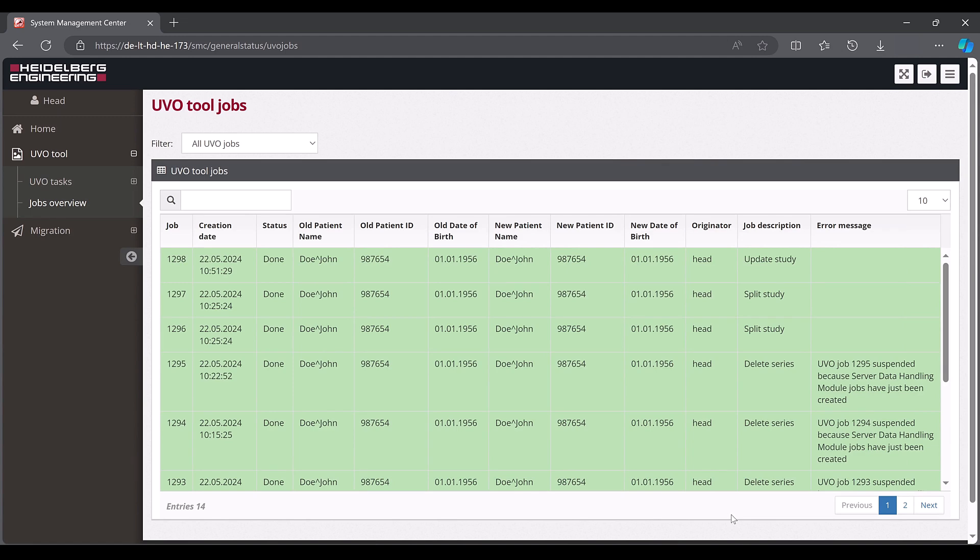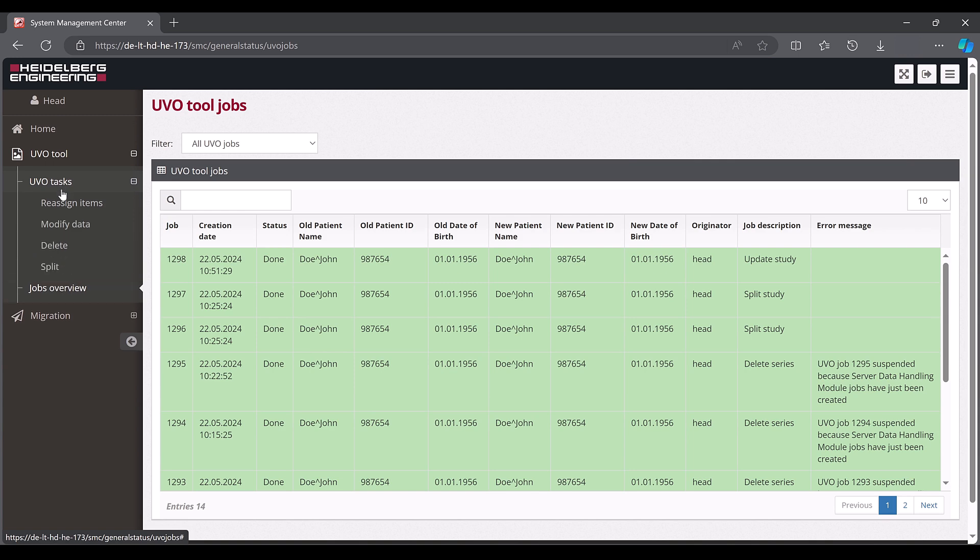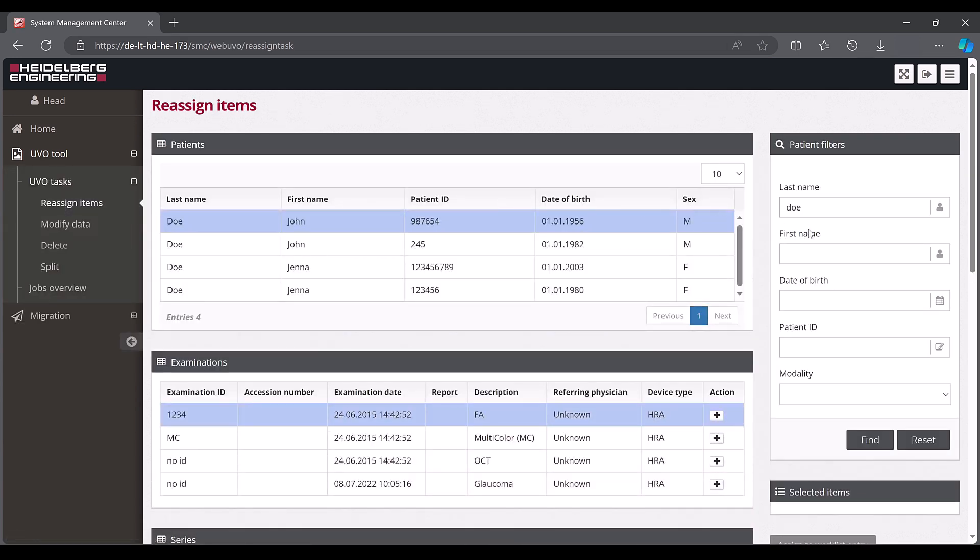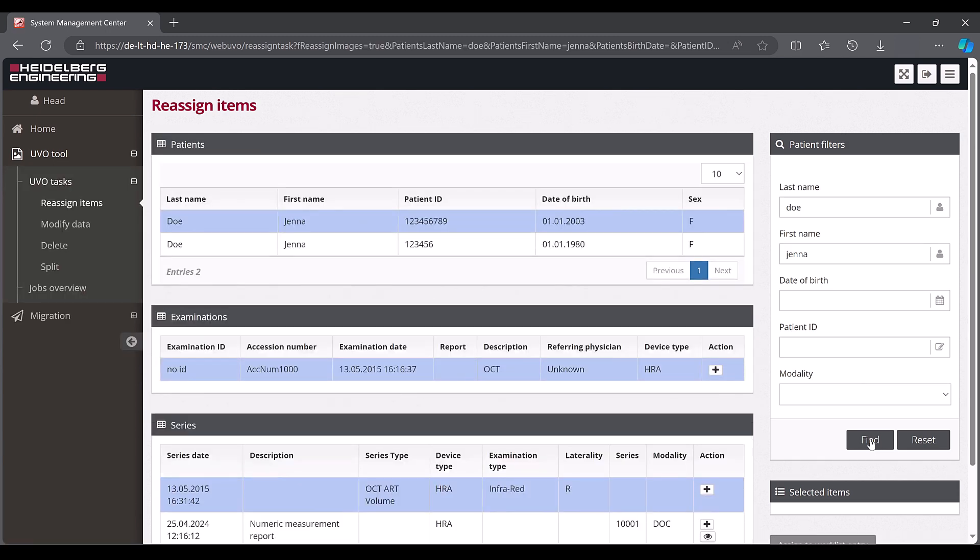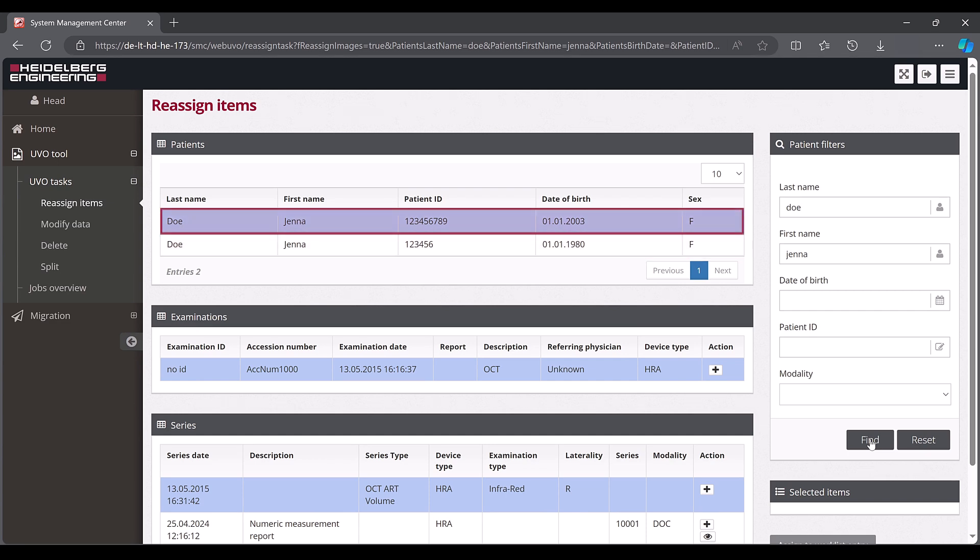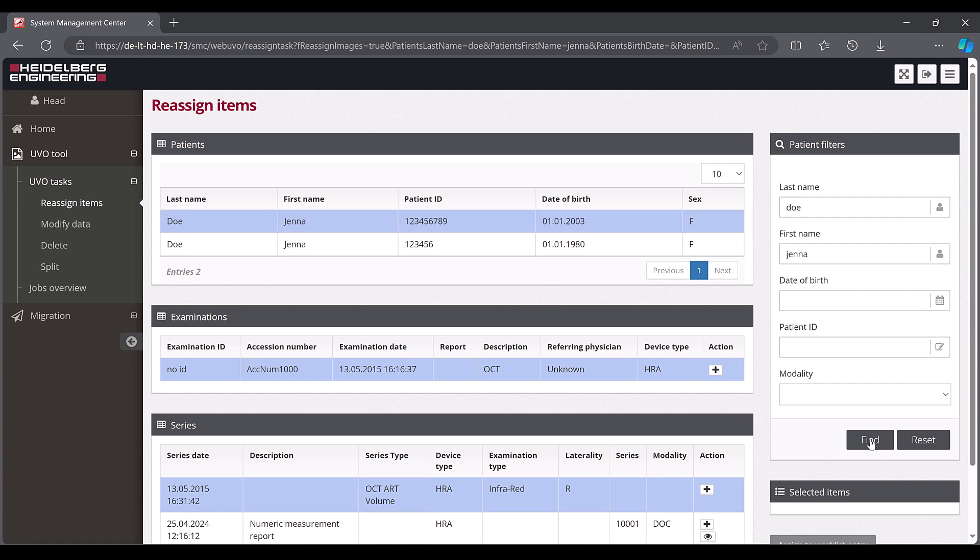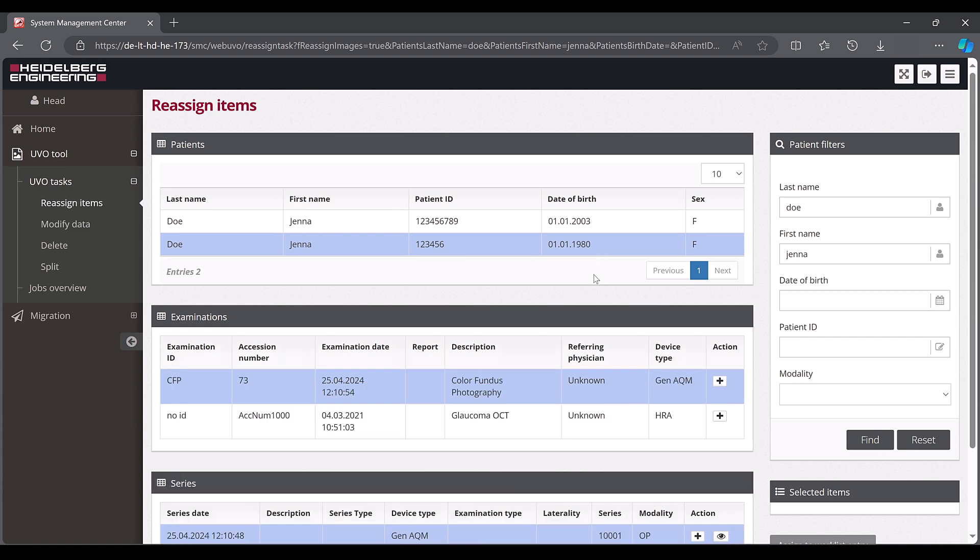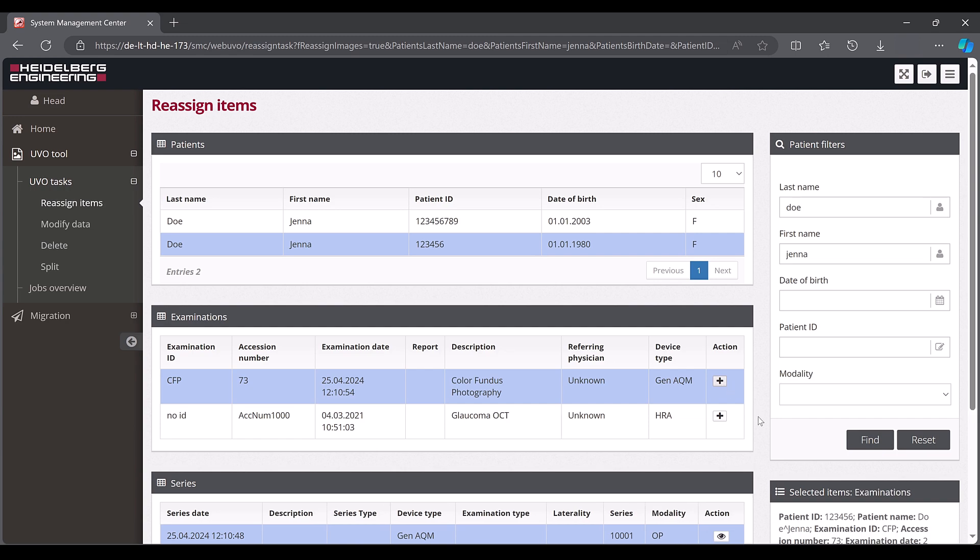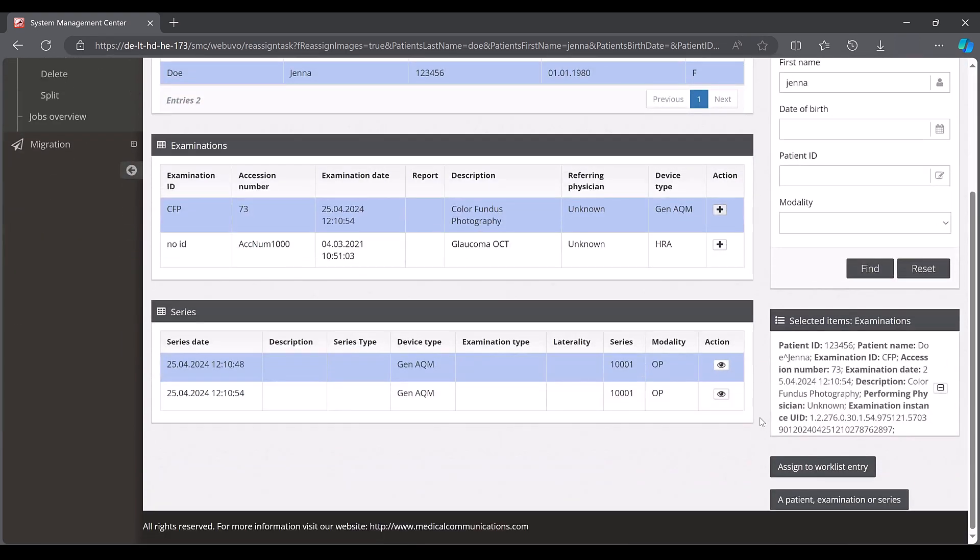In the next step, an examination that was performed under the wrong name should be assigned to the correct patient. To do this, select the reassign items action in the UVO tasks area and filter for the person for whom the examination was incorrectly performed. In our case, we are looking for the patient Doe Jenna and want to move the latest examination from Doe Jenna born 1980 to Doe Jenna born 2003. In a first step, click on the patient Doe Jenna who was born in 1980, then select the items to be moved, clicking the plus button.